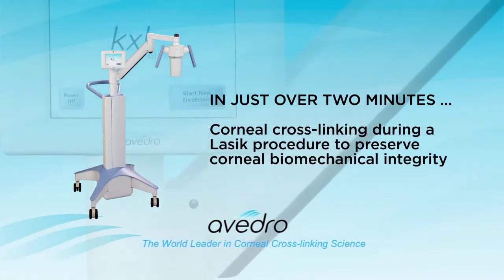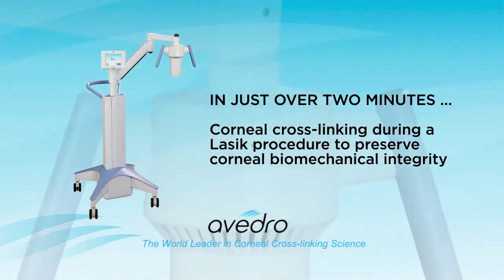corneal cross-linking during a LASIK procedure to preserve corneal biomechanical integrity is complete.